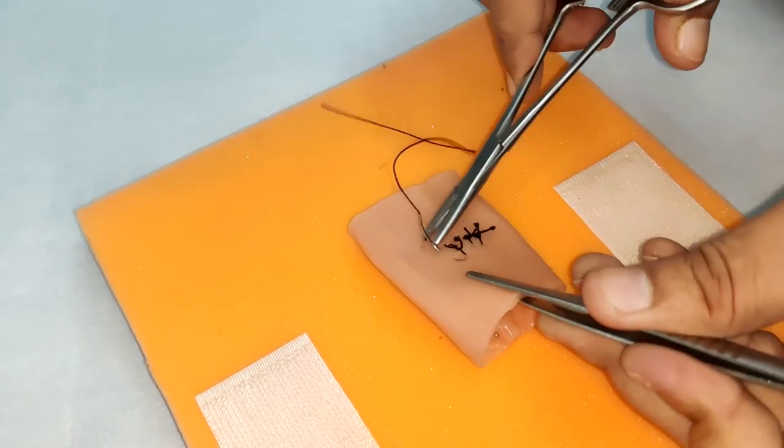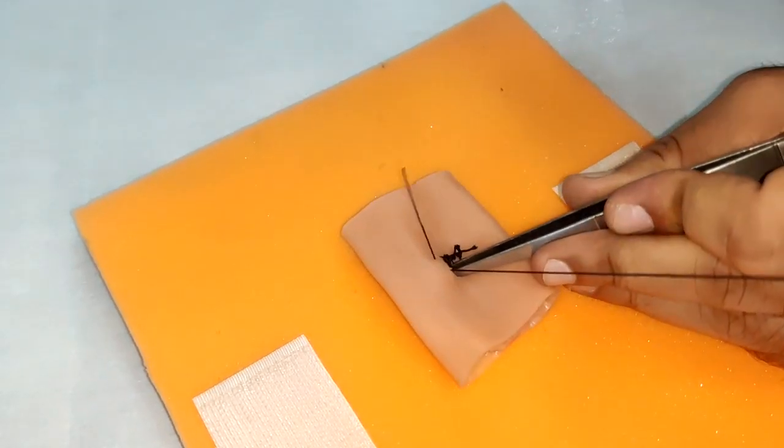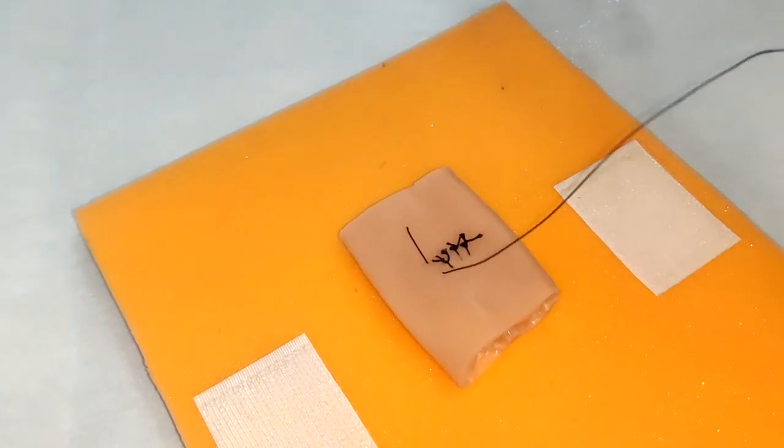Make sure while we are taking this blind stitch, we are not taking the posterior wall of the intestine, otherwise we will cause obstruction of the lumen.